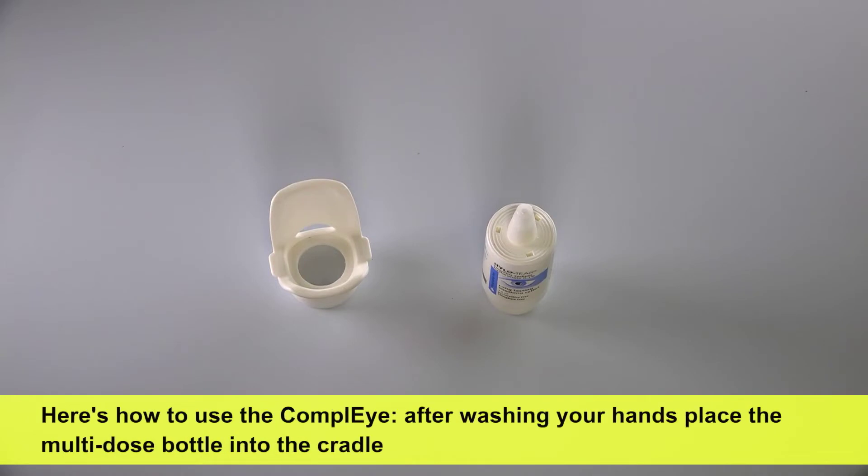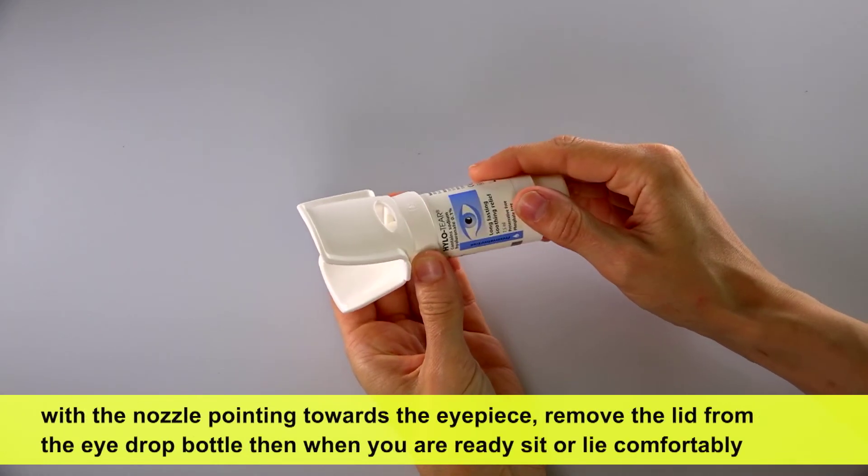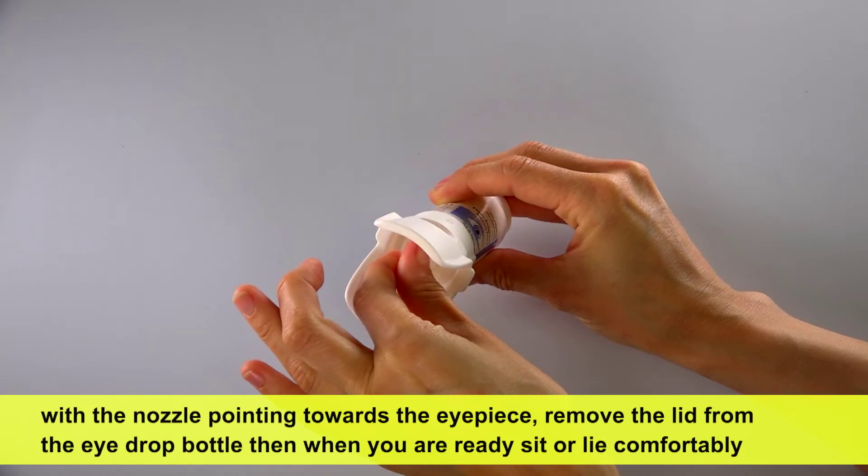Here's how to use the ComplEye. After washing your hands, place the multi-dose bottle into the cradle with the nozzle pointing towards the eyepiece. Remove the lid from the eyedrop bottle.